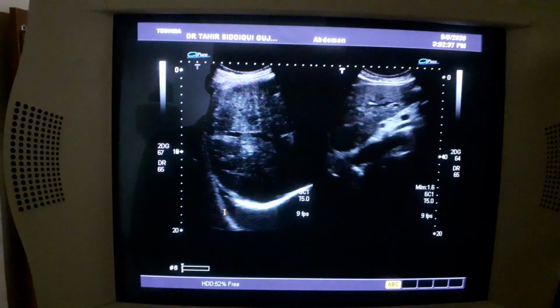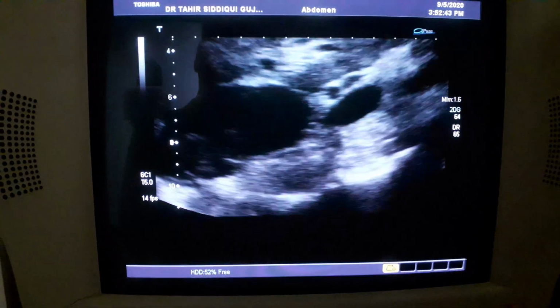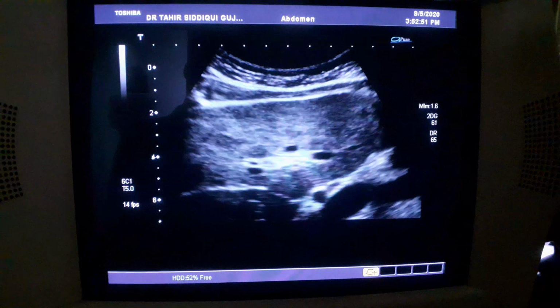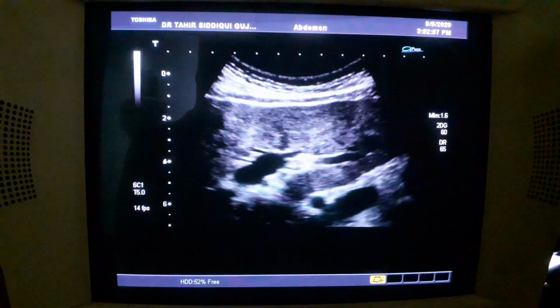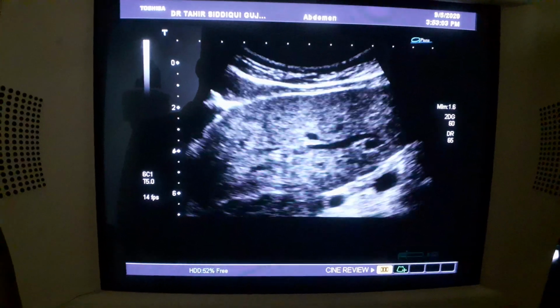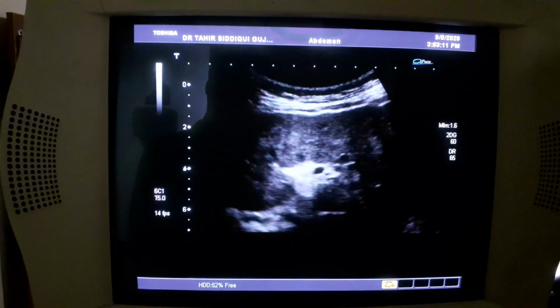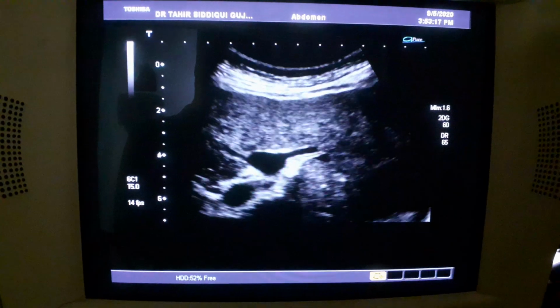So there is no para-aortic lymph node seen. Now the outer surface of the liver and the texture of the liver is not that bad. That gives me an impression that possibly the primary is in the lung. As the prostate is okay, and there is no pathology seen relating to the bowels on ultrasound, and because of pleural effusion, most probably the primary will be in the lung.